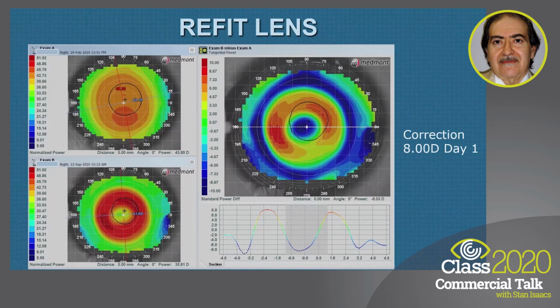So sometimes when you do Ortho-K and things are not working out very well, you need to have a large size Ortho-K lens. If the lens is too large, say for example 14, 14.5, that means when the patient's asleep, there will be less horizontal movements during REM, and when there's less movement, you have less suction, and you're not going to get proper corrections. So you want the lens to be larger to sit on the sclera, but you also want it to be able to move enough to get better correction.